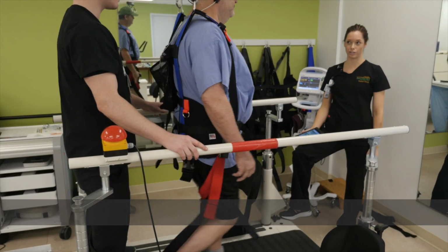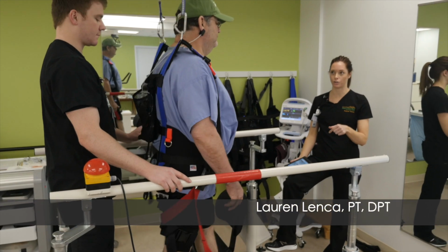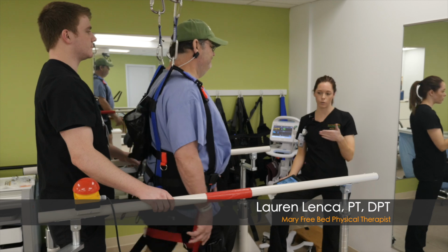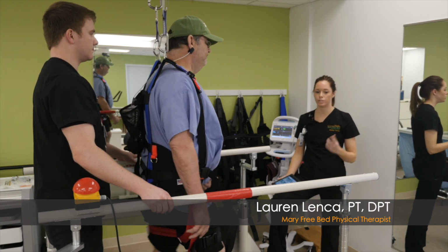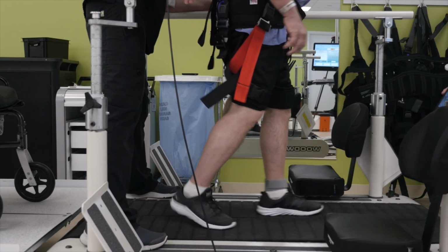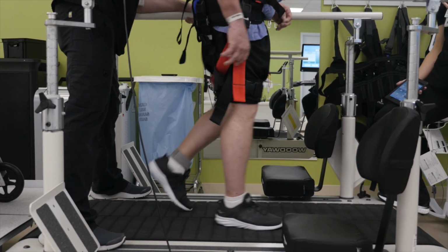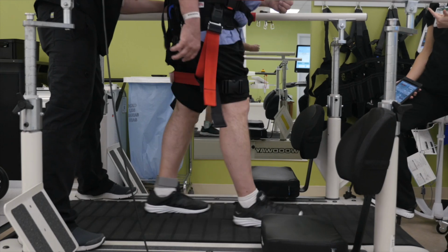I think it was actually your second day of therapy that we got on the treadmill. We didn't waste any time. We took a little bit of weight off of him to make it easier. We did give him some support with his arms. For a long time, he had to use one arm on the treadmill. We started out pretty slow, 0.5 miles an hour. We would bump him up to 1.0. He felt really uncomfortable with that.